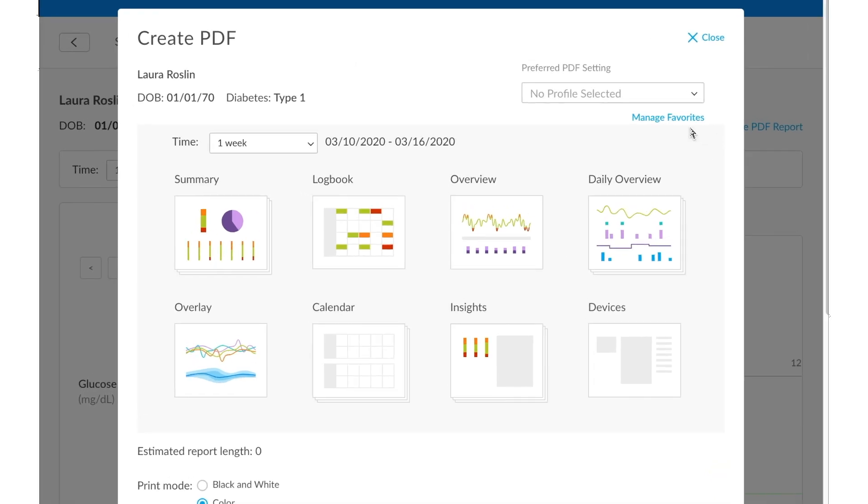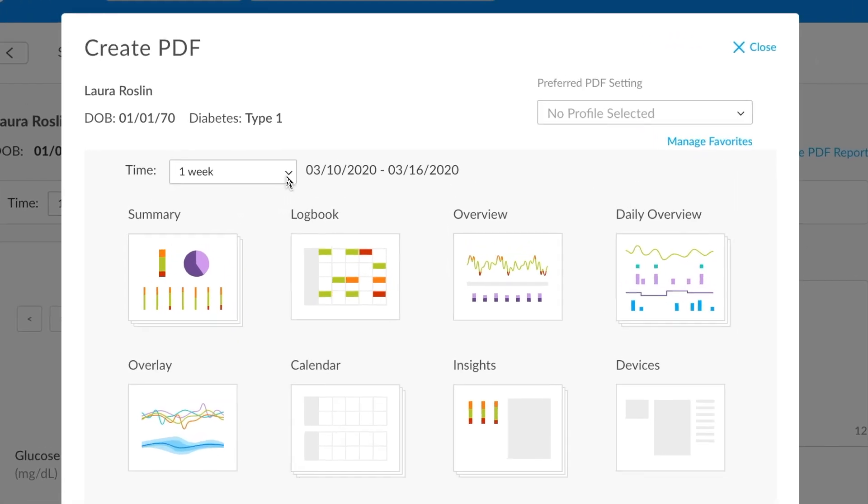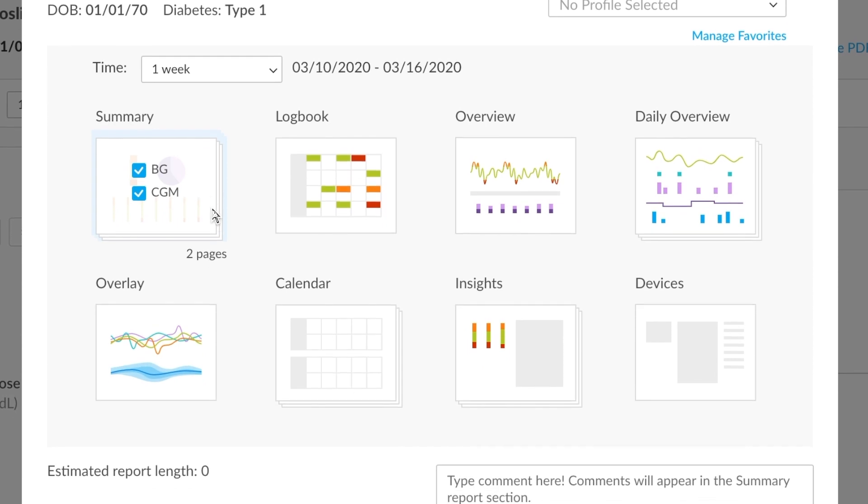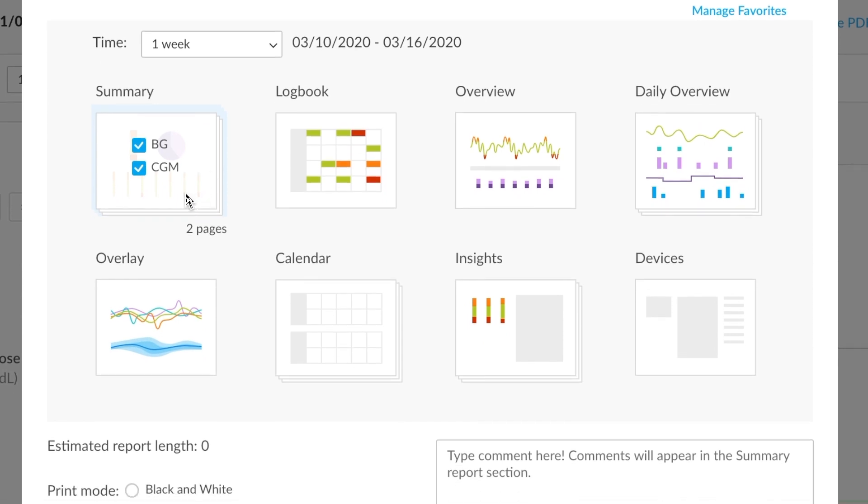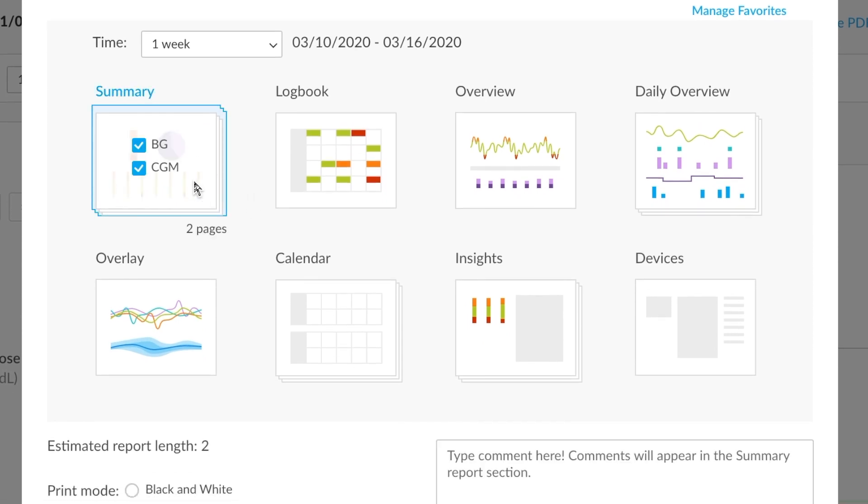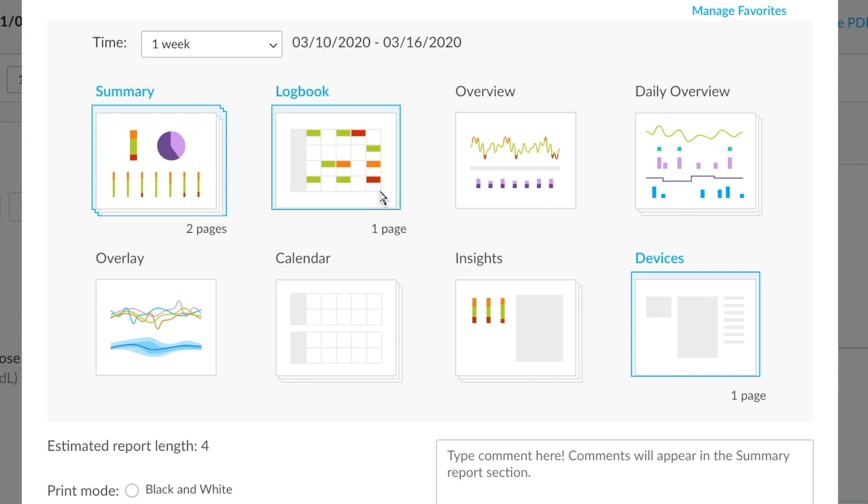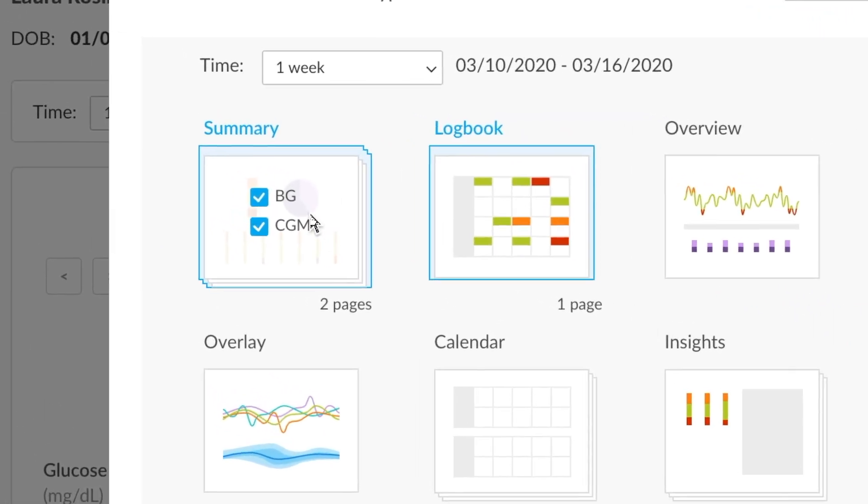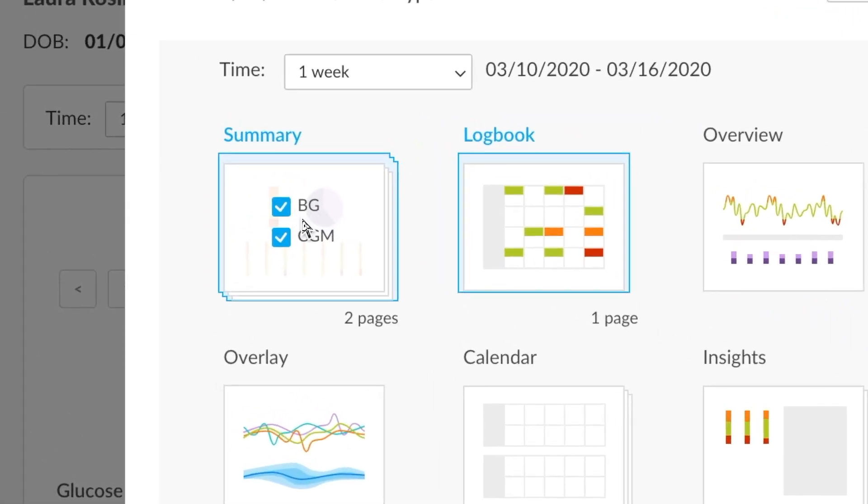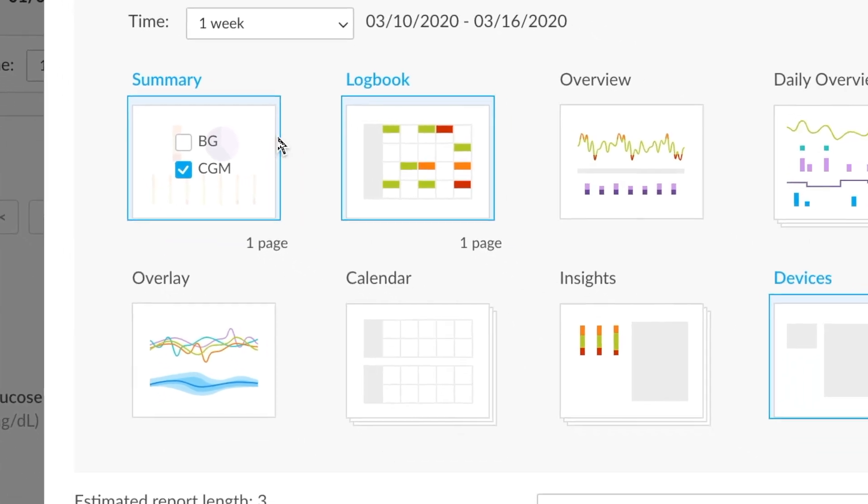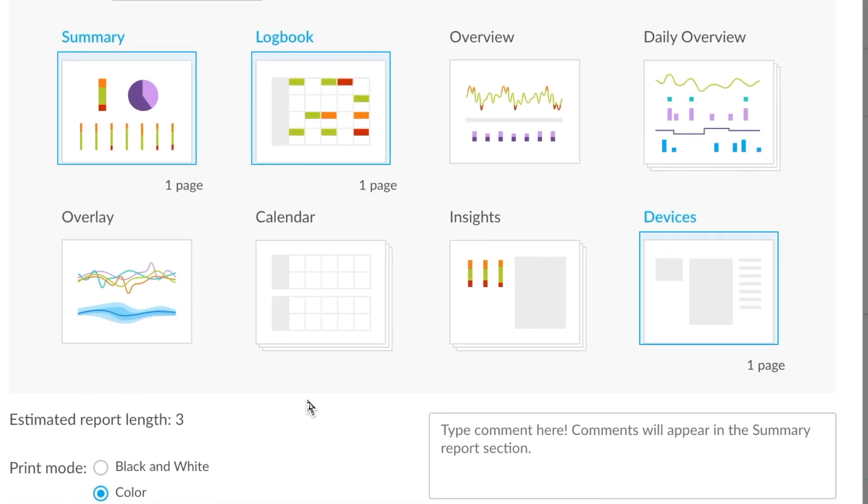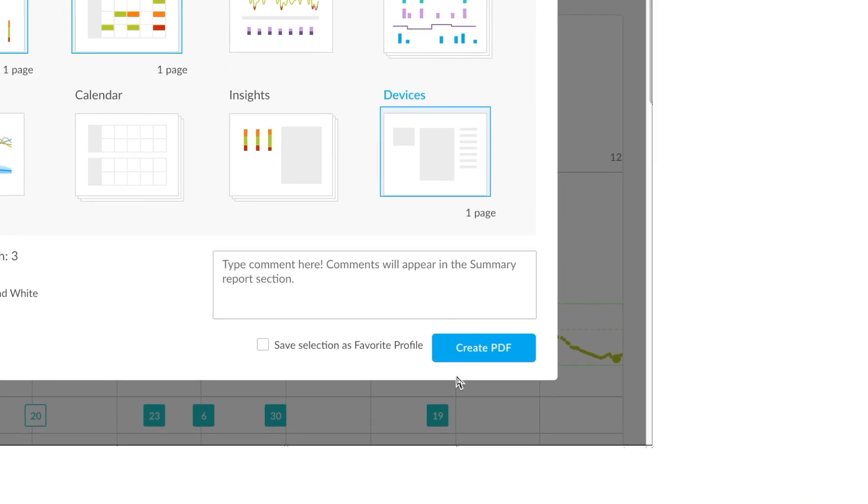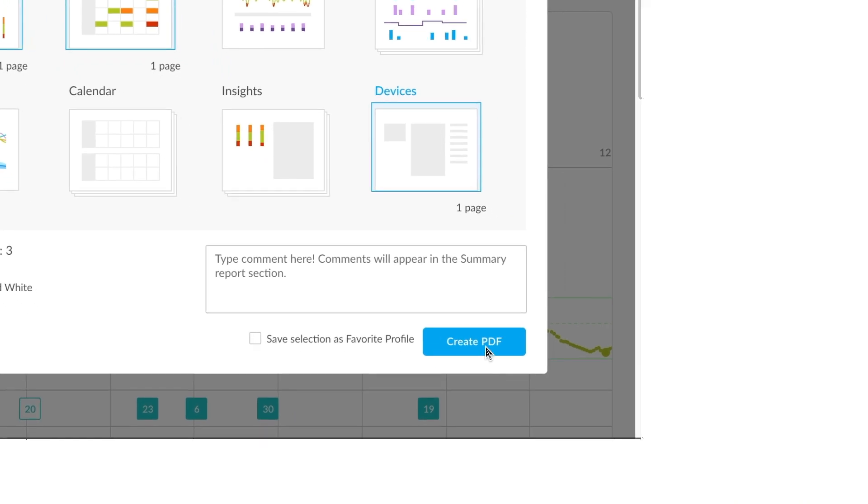Some options you can choose are the time frame. You can choose which reports you want to include. Let's say let's say we want to include the summary and devices and maybe the logbook. And how about for the summary, instead of displaying BG, we just want CGM data. Let's go ahead and take that off of there. To complete the process, you can go ahead and click on the Create PDF option here.